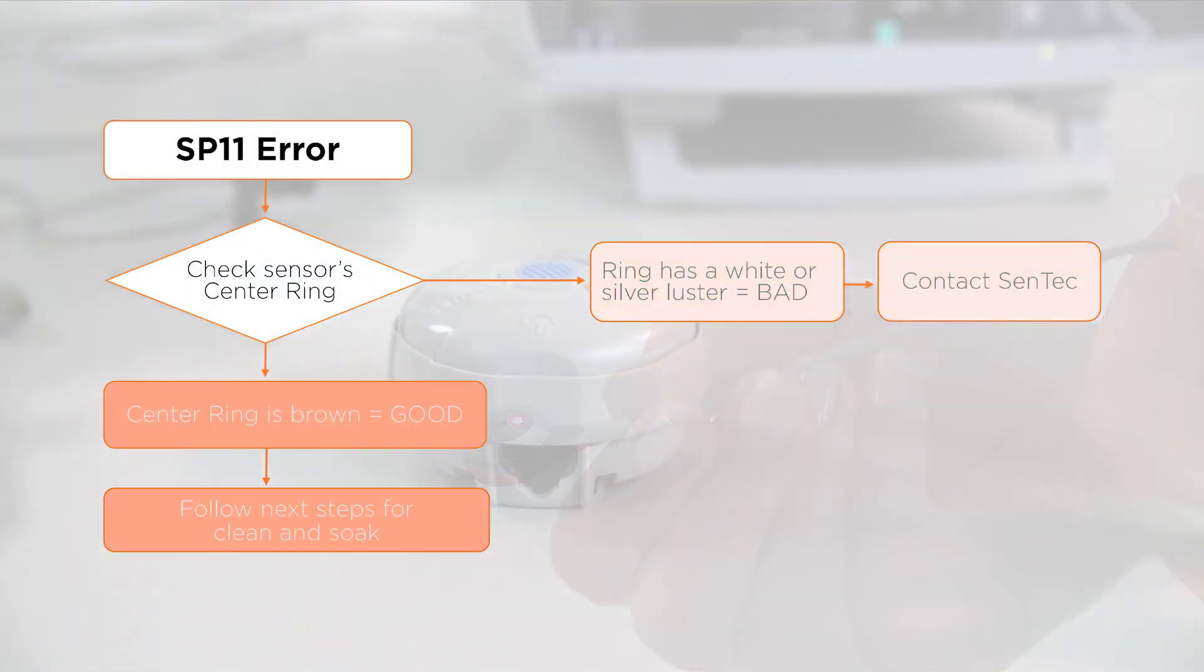If the center ring is brown and intact, follow the next steps for a clean and soak.